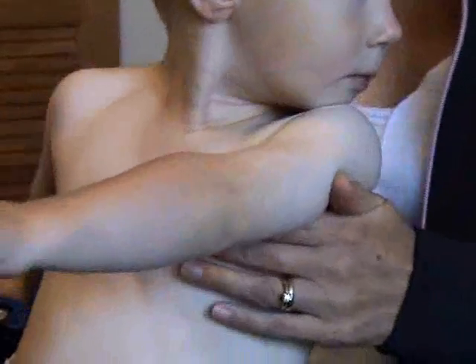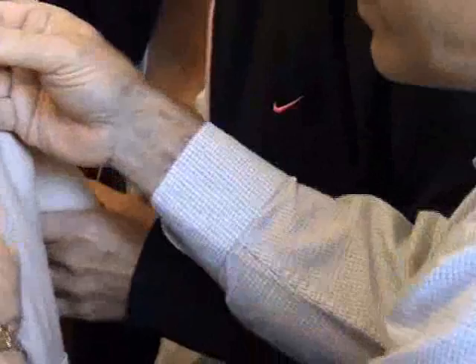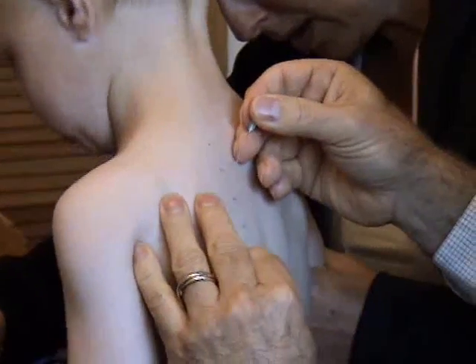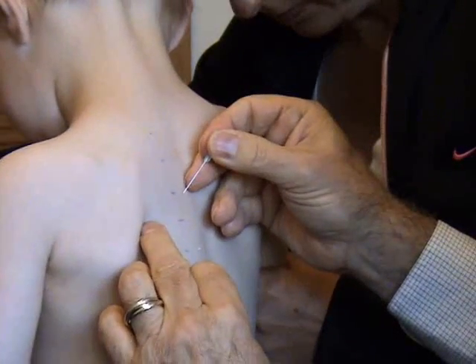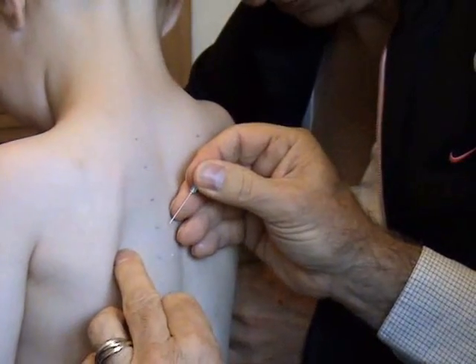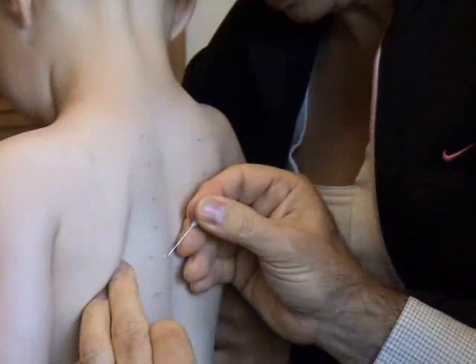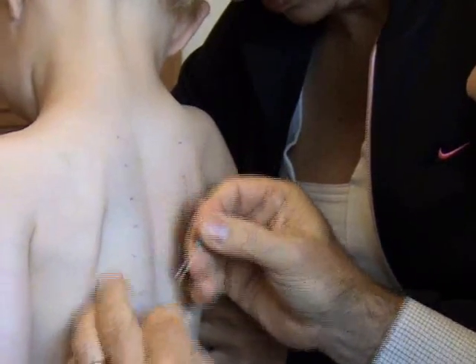And now Josh, I'm going to touch you very gently with a little tickle on your back. Turn around. I'm going to touch you very gently on the back — that's the way, just a touch, just a little tickle. And then we're going to wait for about 10 minutes, and a positive result comes up like a little mosquito bite. One more here. Great, thank you.